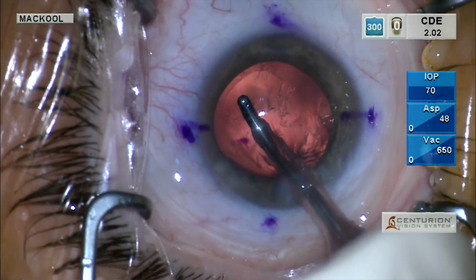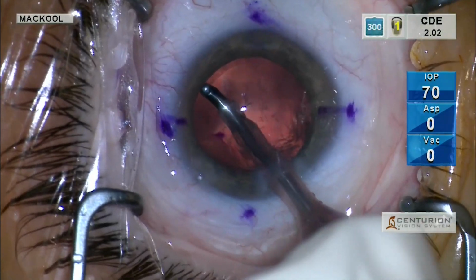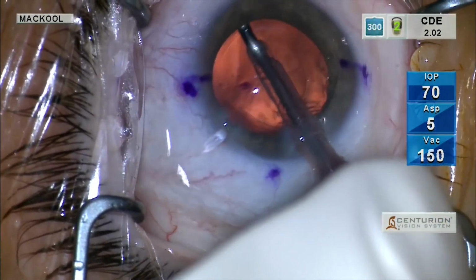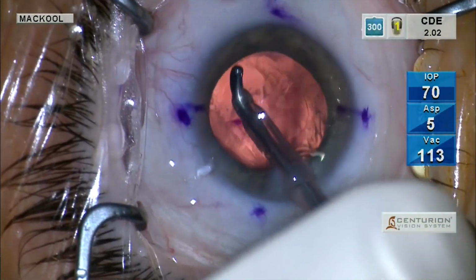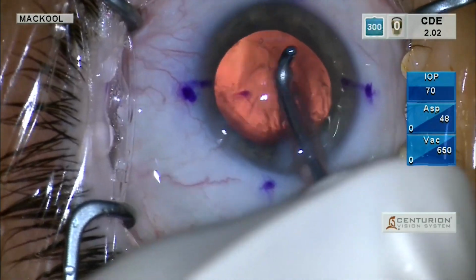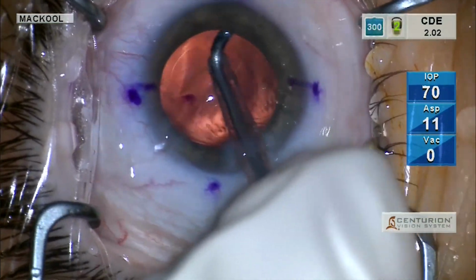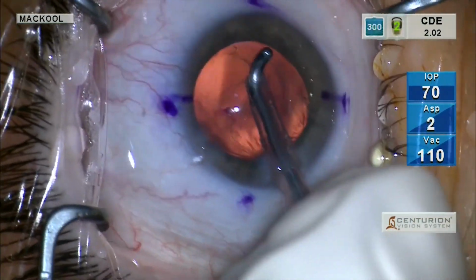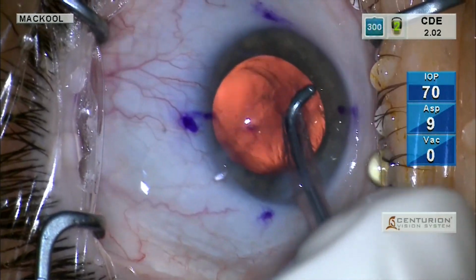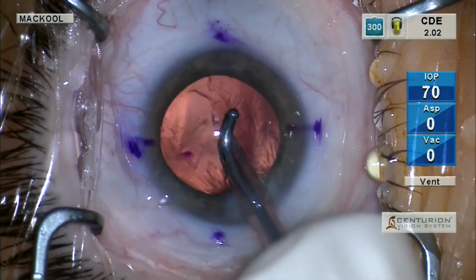Okay, final step, with an I/A at least, is to remove epithelium from under the anterior capsule. And you can see the vacuum levels that I achieve and the flow levels. They're relatively low, and that's because I don't fully depress the foot pedal. But you can set this in the machine as your vacuuming setting.